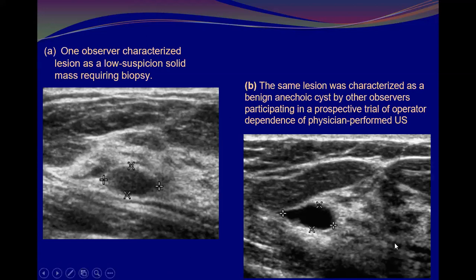But this is good. This is gray, medium gray. The fat is medium gray in the pre and in the retromammary region, and even the fat within the glands. It looks medium gray, almost the same. And the difference, that is why the echogenic fibroglandular tissue from the fat, now here there is contrast.